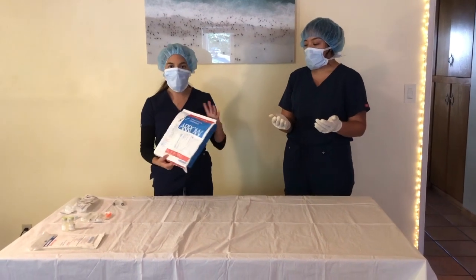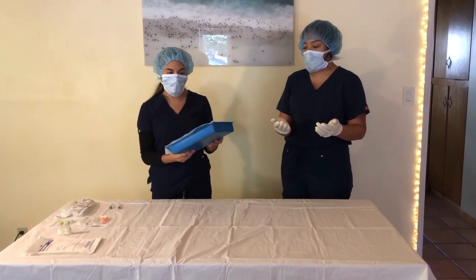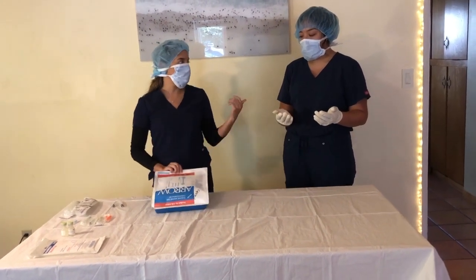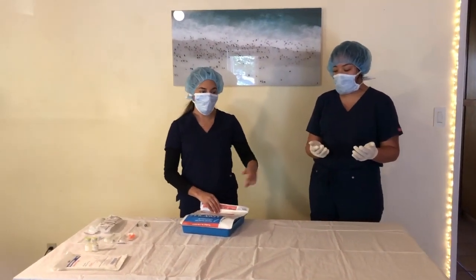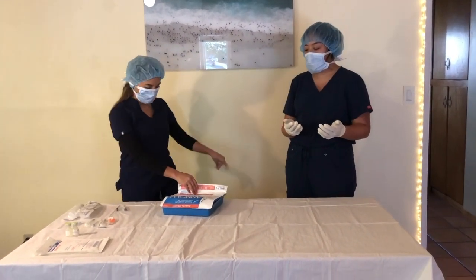This is a sterile tray, which I've checked for the expiration date as well as to make sure that it's not damaged or wet, and it's not. I'm gonna go ahead and open it for Celestine, who's gonna be the sterile one in the video, and she's gonna go ahead and open up the sterile tray and organize all the items inside of it.